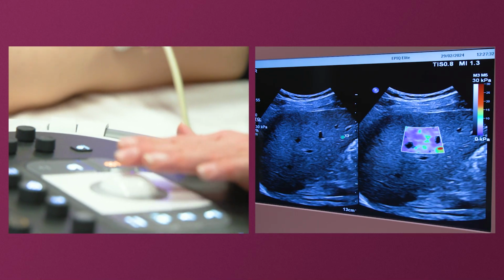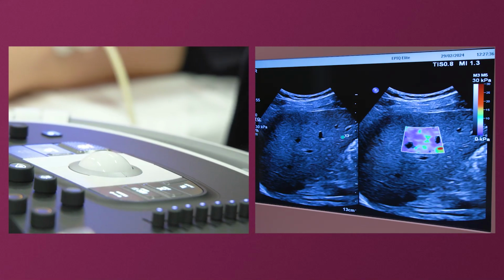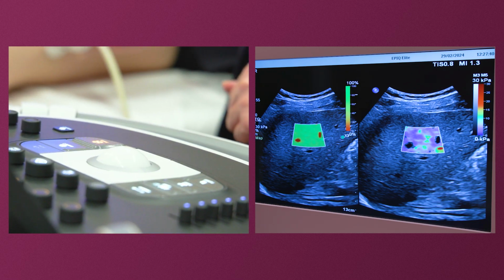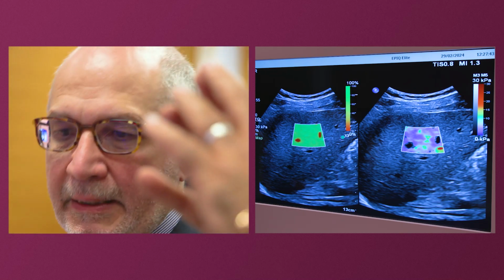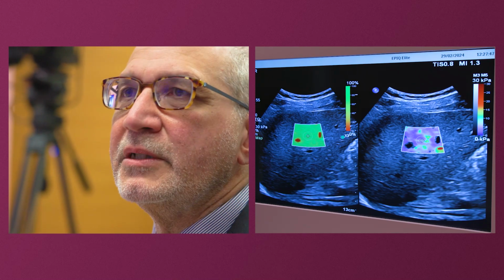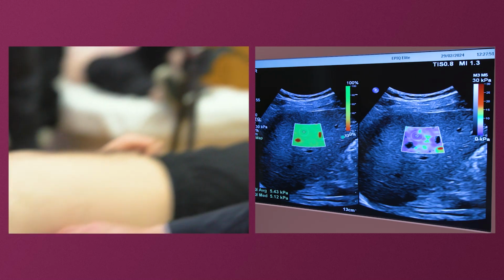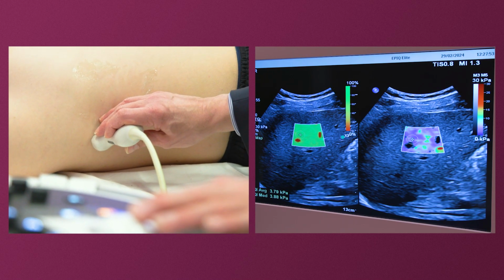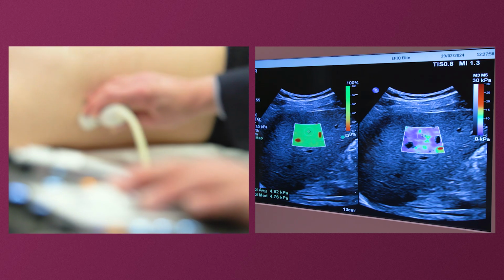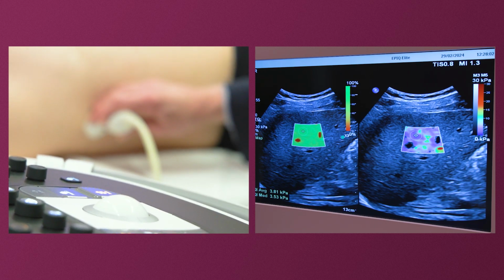Okay. You can scroll, so you can go backwards and forwards to get the better picture. If you want to see the confidence map on here, which is the best area? The red is no good, it's the vessel, yeah? Yes. So then you've got the circle diameter, okay, and you're going to measure, and then you can put it where you think it's best. Yeah, see how again it'll change where you put it. So you want to be confident of where you're going to put it. That's the best reading, you think, or the most accurate.